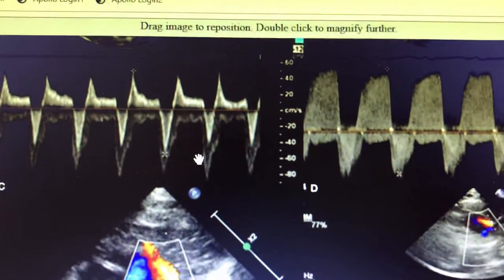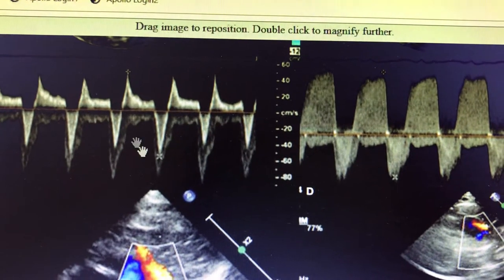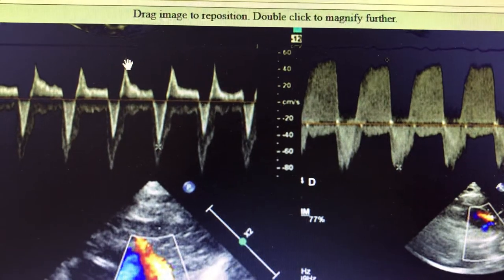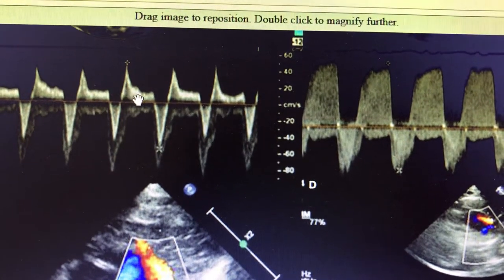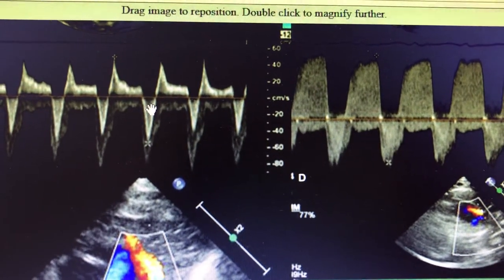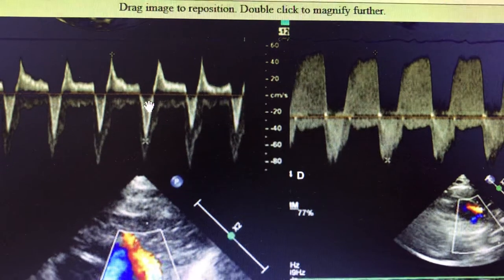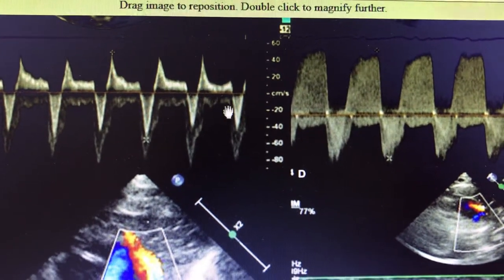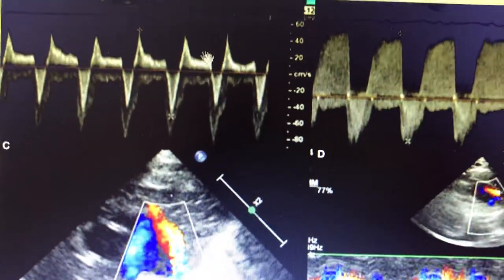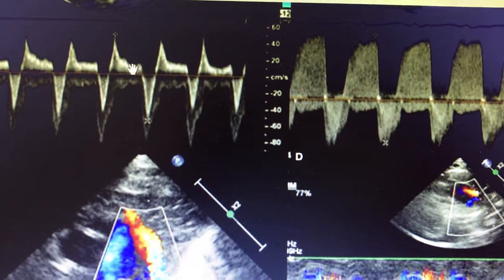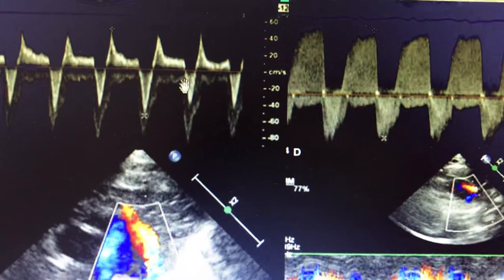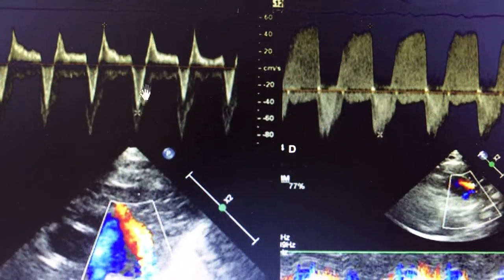If you put the continuous Doppler, you can also see that there is a bidirectional shunt. Almost throughout the diastole the flow is coming towards the cursor — towards the pulmonary artery — and almost at the end of diastole and peak systole it is going slightly away. Other than that, every time and in some part of systole also the blood is coming towards the PA, but at the end of systole there is a slight push of blood into the aortic side.